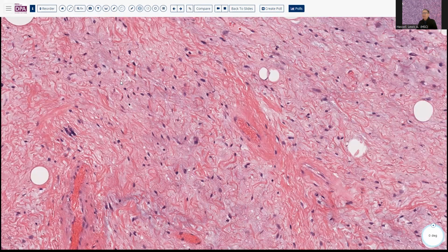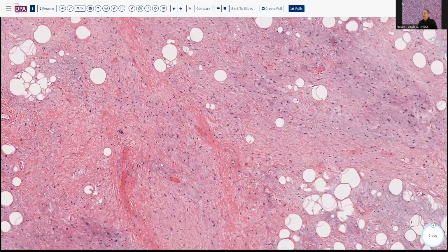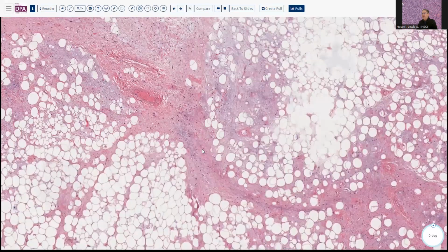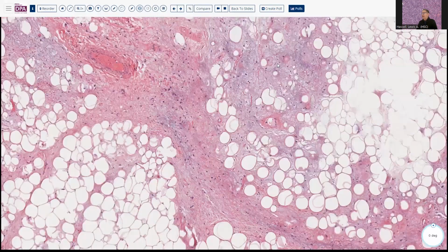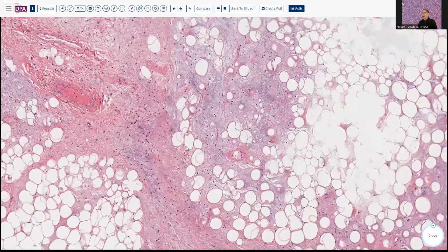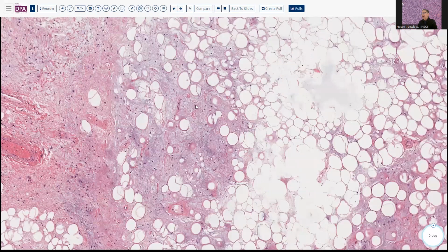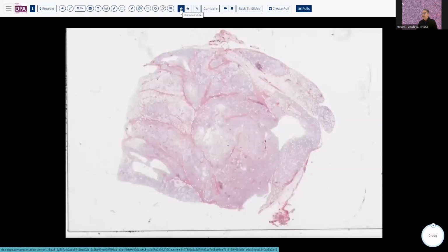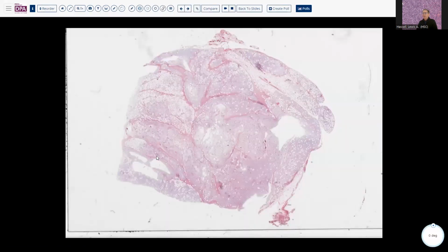Now notice that these have a fibrillar collagen here. This is not the coarse collagen of pleomorphic lipoma. So again, this should be enough to warrant further testing and evaluation for well-differentiated liposarcoma. Now, the other thing to remember here is that occasionally these sorts of changes can be associated with scattered clusters of lymphocytes. And we've seen a number of cases where we get biopsies of these lesions, and people are concerned about lymphoma or sclerosing mesenteritis or whatever, and they fail to appreciate those atypical stromal cells.